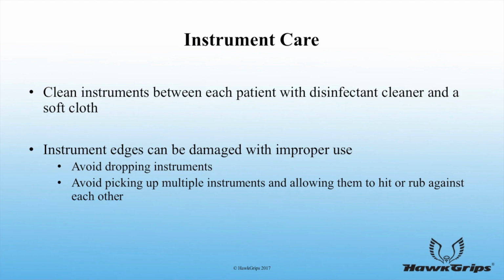We always want to clean instruments between each patient with a disinfectant cleaner and a soft cloth. While the instruments are made with surgical-grade stainless steel, the edges can still be damaged if dropped. Please take proper care of your instruments to ensure longevity of the product.